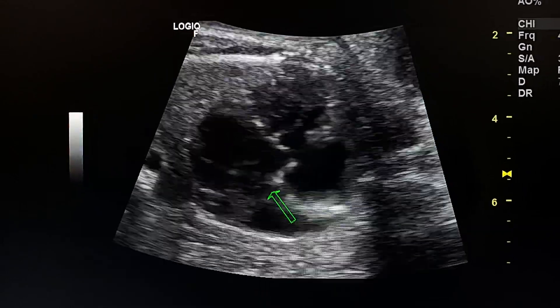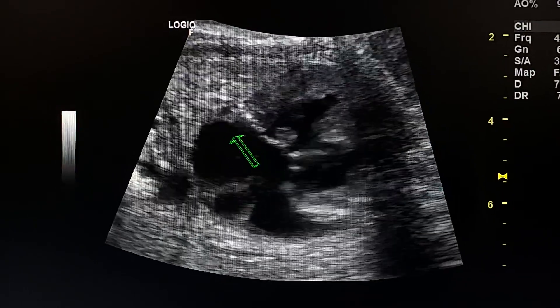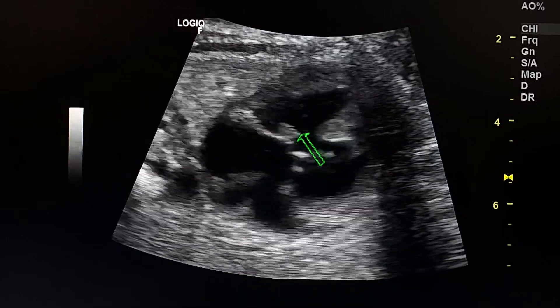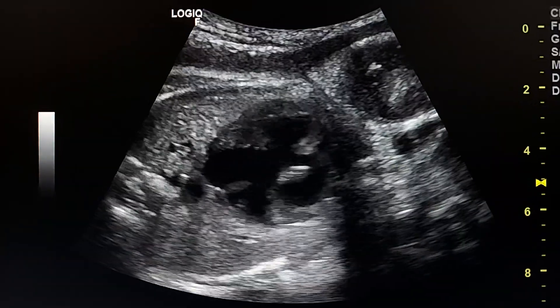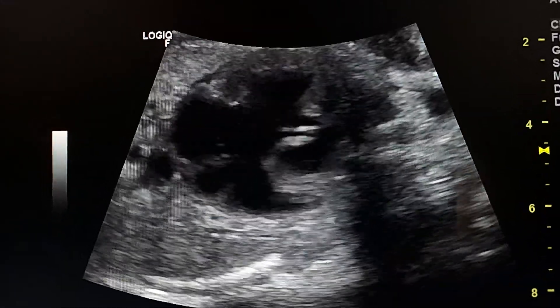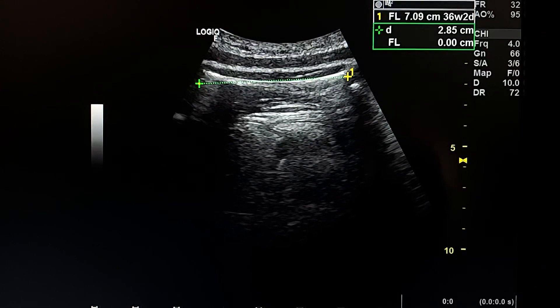Here is the ASD, which allows blood to pass to the left atrium, then to the left ventricle, and to the right side of the heart. Gestational age is 36 weeks and two days.